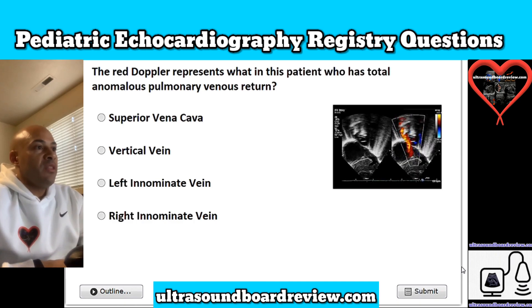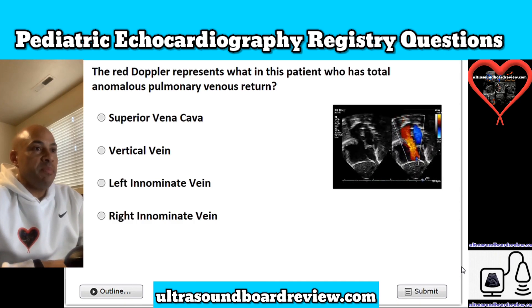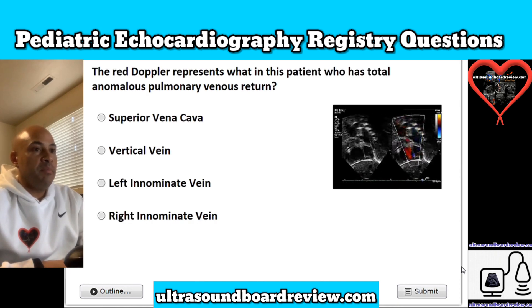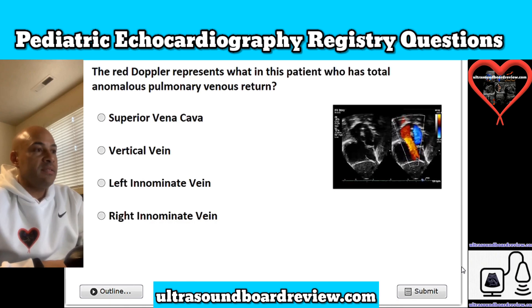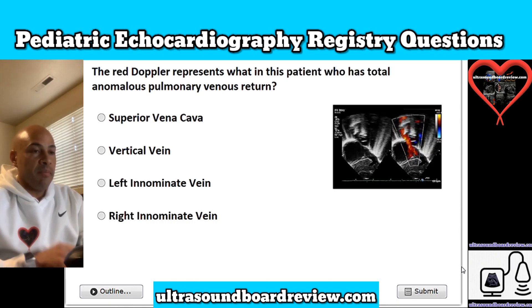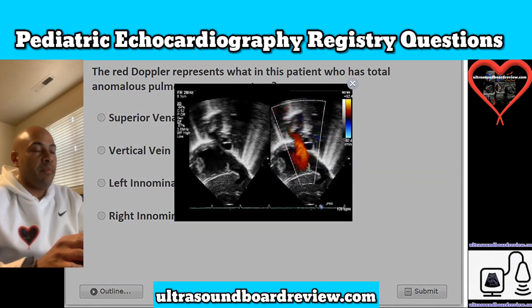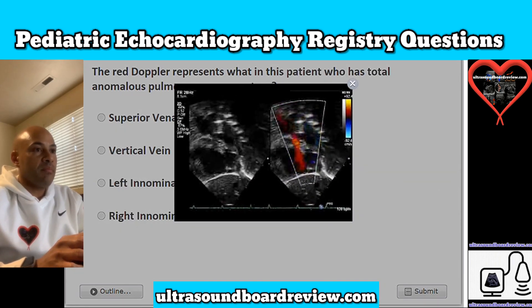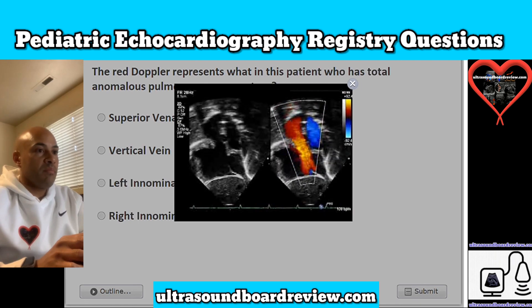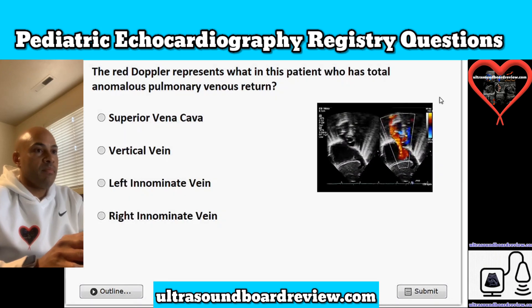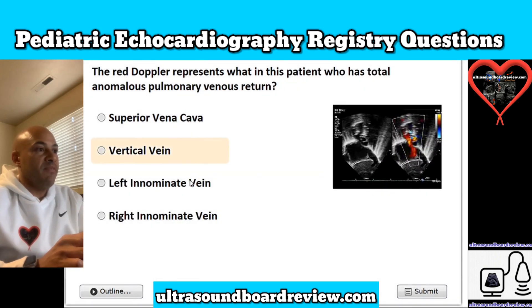Question 20. The red Doppler represents what in this patient who has total anomalous pulmonary venous return? Is it A, superior vena cava; B, vertical vein; C, left innominate vein; or D, right innominate vein? The answer is B, vertical vein.